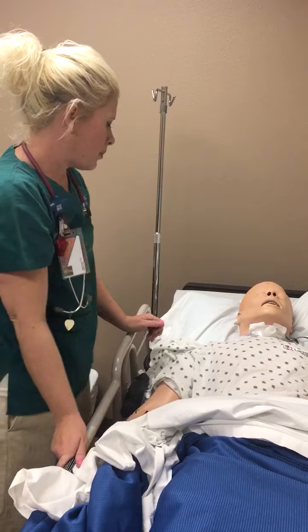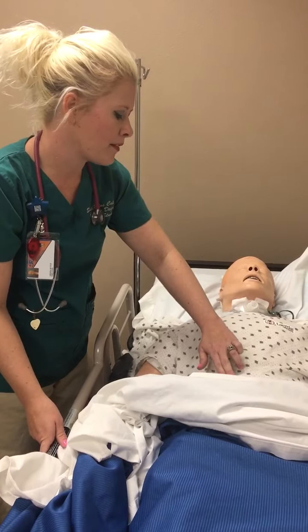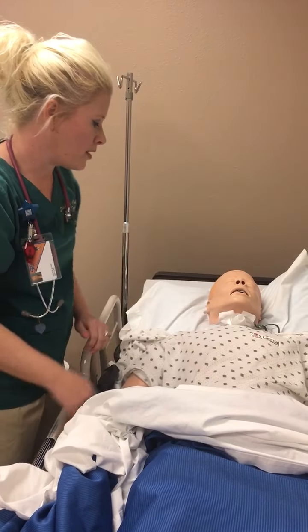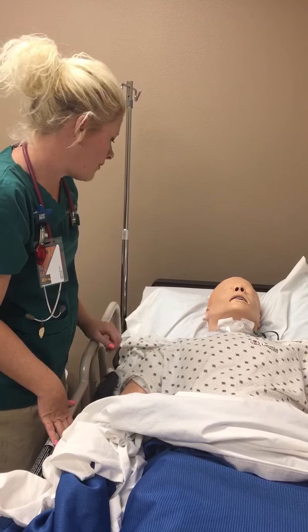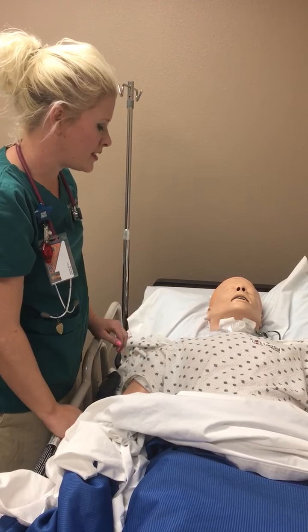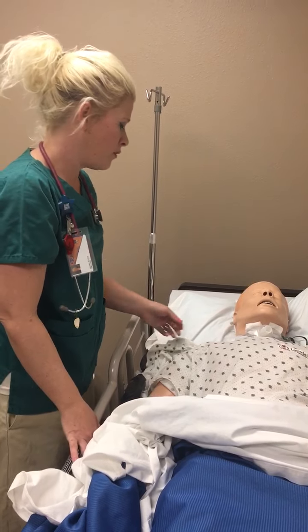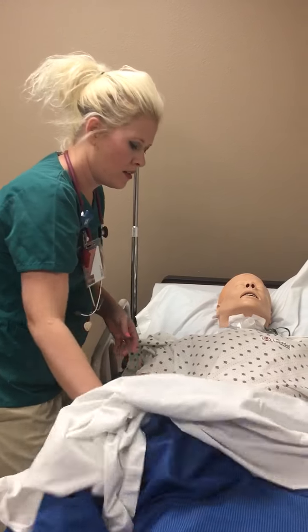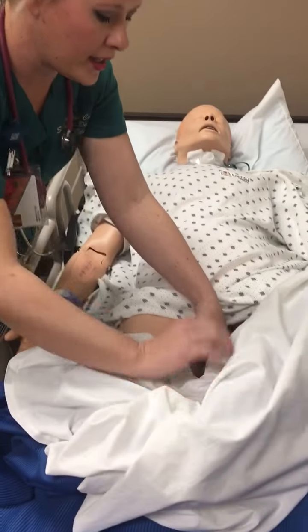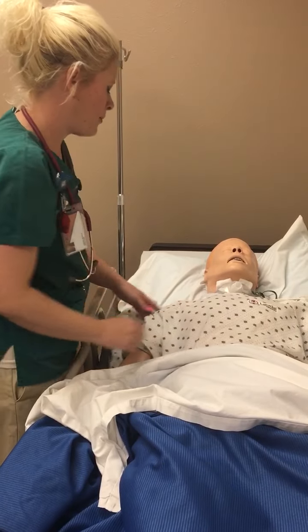So heparin, the preferred site is going to be in the abdomen. We're going to do 2 fingers on either side of your belly button. Have you had it in your right or your left? You had it in your left last? Okay, we're gonna give it in the right side then. Other places, if you had another sub-Q injection we could give would be in the back of the arm, the skin fat, or we could also go inside of the leg. Today we're gonna give heparin, so we're gonna go ahead and give it in your abdomen.